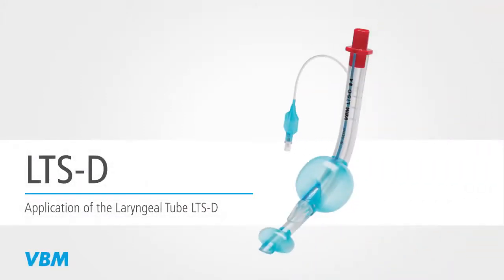This video animation shows the insertion, placement, and removal of the LTSD.